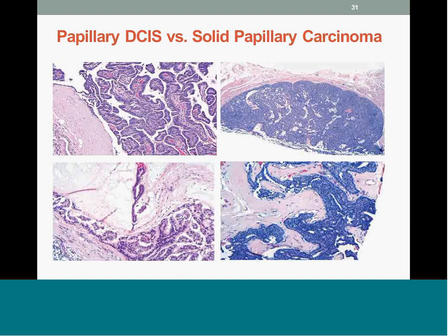With some of these papillary carcinomas, they can be quite challenging. This top frame here is intended to represent a case of papillary DCIS in which there was no myoepithelial cell layer, and cytologically the cells are very bland and monomorphous. Here's a case of papillary DCIS with a lot of mucin, which can give a lot of diagnostic challenges too when you have mucin in these lesions.